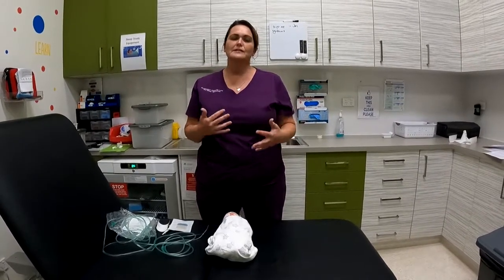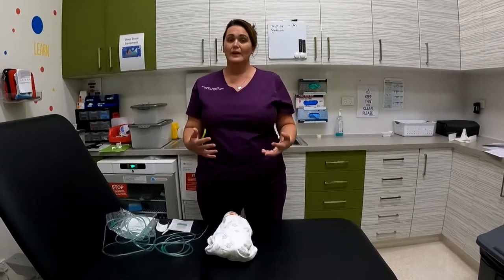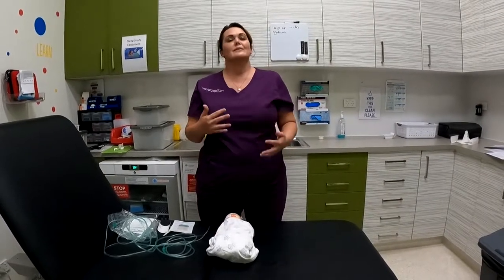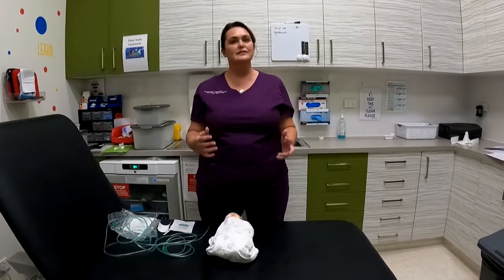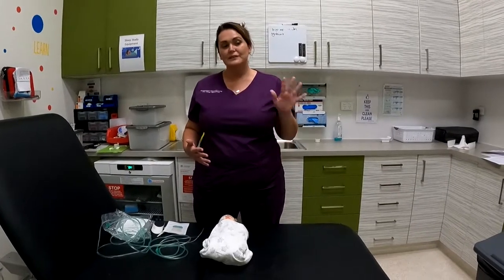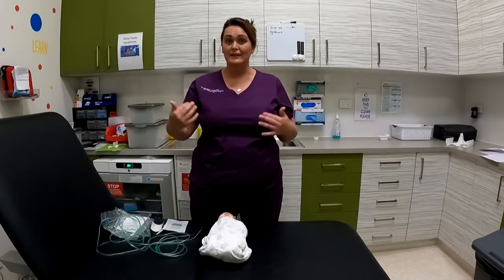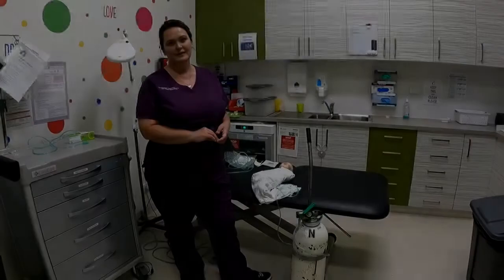A lot of the things about identifying if your baby's looking really unwell and working hard isn't just because it's on oxygen. This is what you would do with any baby that you had at home. If you walked in and they were really struggling and you were really concerned, you'd call an ambulance. Same thing if they're on the oxygen. I guess one of the things is you've actually got oxygen at home, so you can turn them up and give them that bit of oxygen while you're waiting for help to arrive.